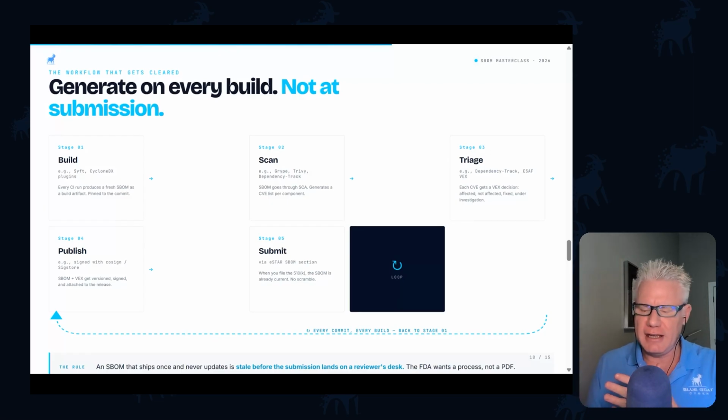And the FDA is going to reject that submission as well because they want to see that you actually not just do this as a one-time study, but do this continuously because, as I mentioned, threats constantly evolve. And what today could be low risk, tomorrow could be high risk if somebody publishes a new exploit on the internet that can easily take advantage of a vulnerability.